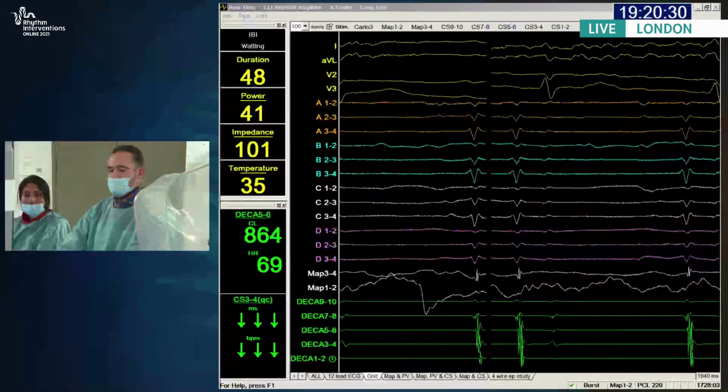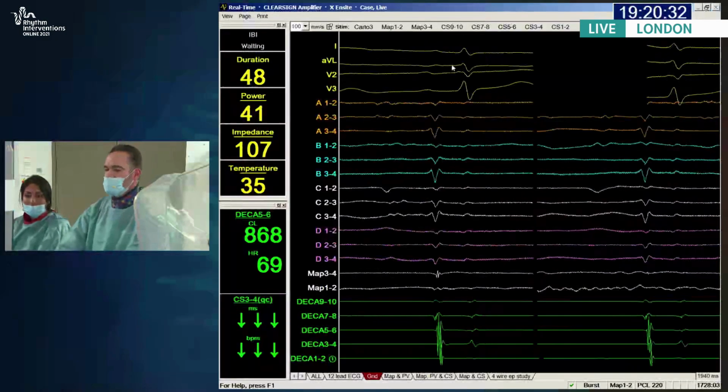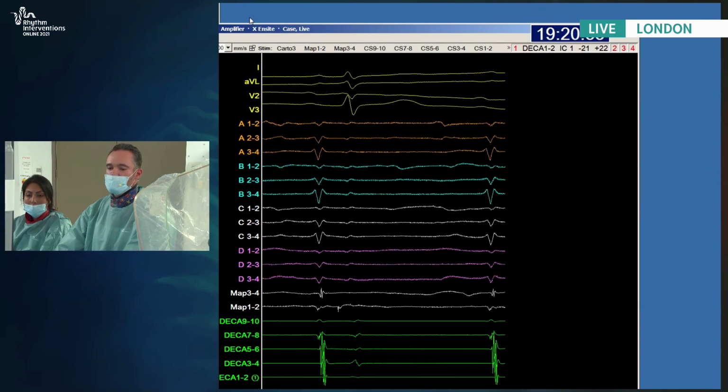Ross, can you show us the BARD signals on termination? Yeah, if you could just maybe bring that review screen over for us.